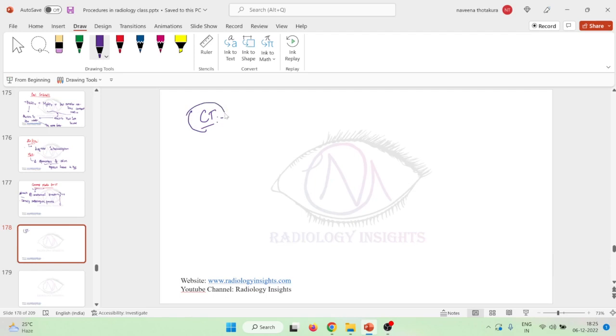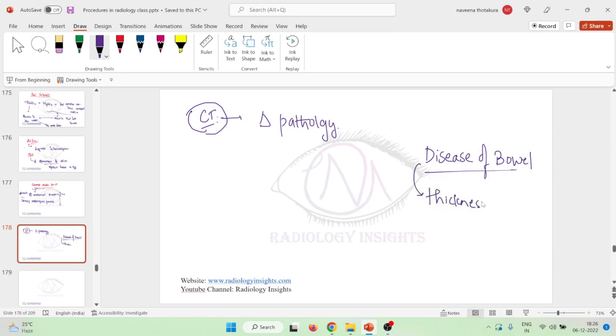Before thinking about contrast media in CT, one most important thing for diagnosing pathology is to distend the bowel. Many diseases of the bowel mainly manifest as thickness of the bowel wall, or some growth occurring from the bowel wall, like polyps.